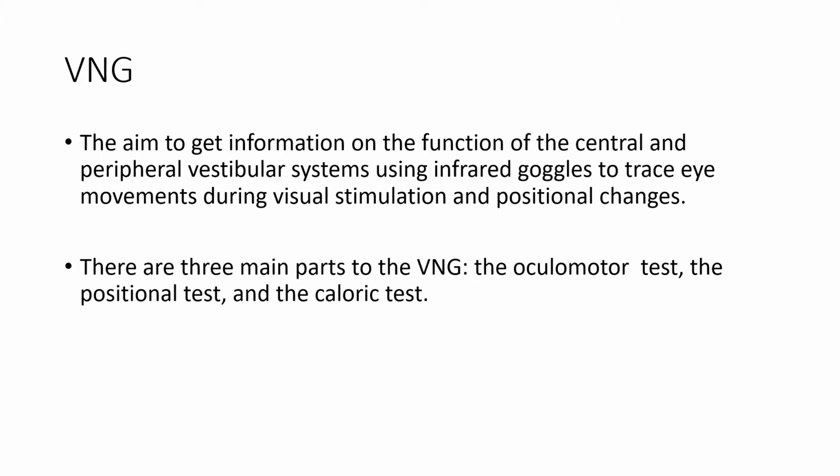In this test, we measure the involuntary eye movement, which we call a nystagmus. So this nystagmus or this eye movement can be slow, fast, steady, or jerky. It happens when the brain gets conflicting messages from the eyes and the balance system in the ear. So this conflicting message can make you dizzy.